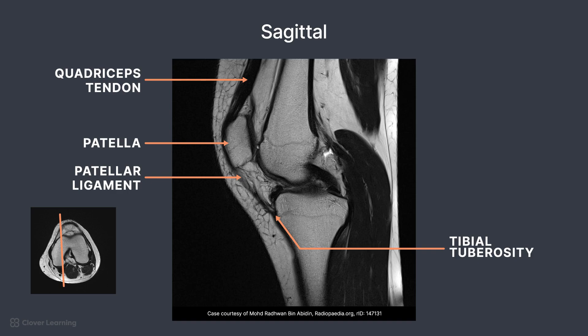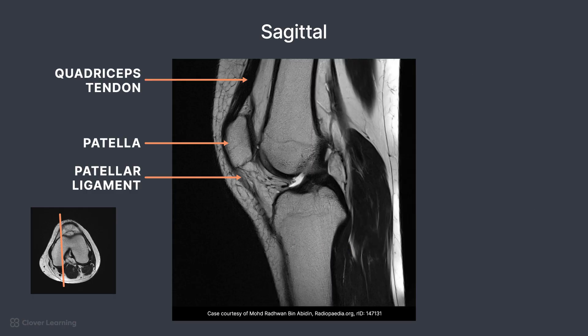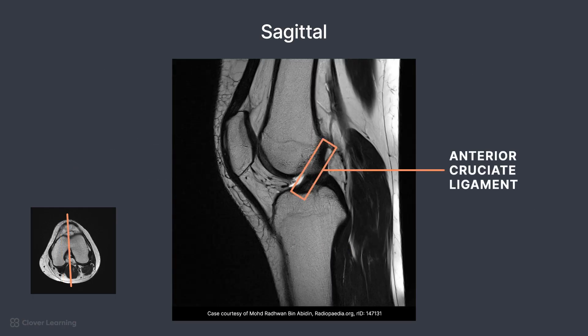Remember, tendons attach muscles to bones, and ligaments attach bones to bones. Posteriorly, the gastrocnemius muscle is seen wrapping from behind the tibia and up behind the knee joint, and the semimembranosus muscle is located behind the femur. At midline, the anterior cruciate ligament is seen connecting the femur and the tibia — this structure typically looks like a diagonal straight line.